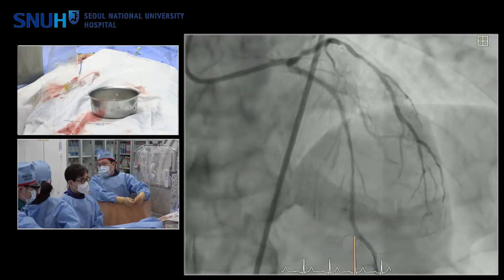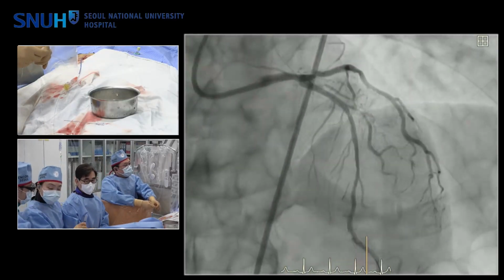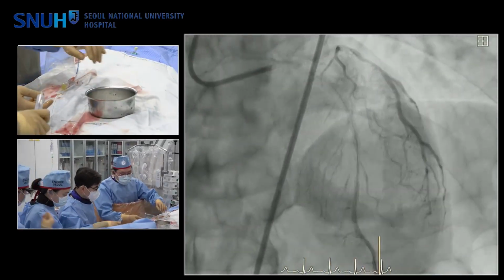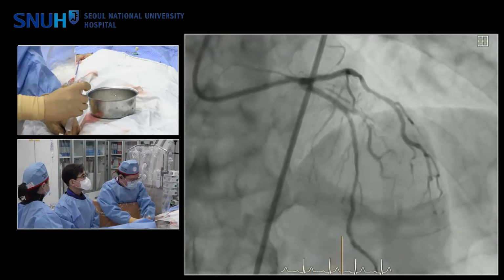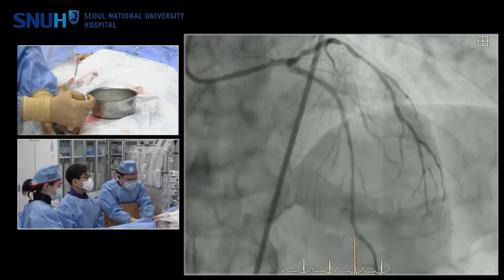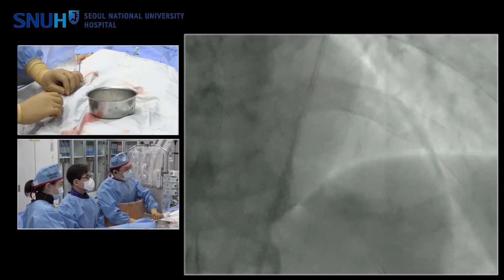20 pulses is too few for bad lesions. The other thing is that you're trying to get IVL to work in concentric, thick, and calcium nodule. It works quite differently. I think in those cases where it's concentric calcification, it works quite well. And it's actually quite nice to test it with a balloon, like a cutting balloon. If it doesn't expand, more pulses of IVL in that segment will help a lot.